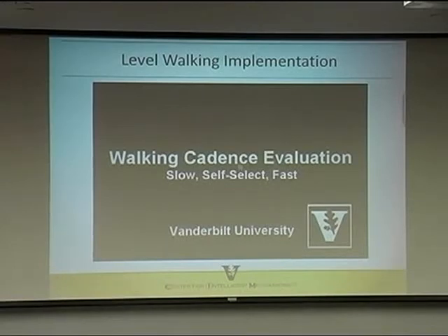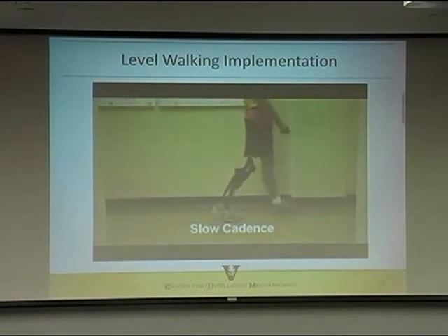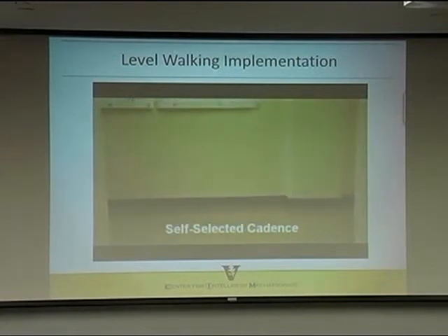And so this shows a subject walking at 3 different speeds, first in regular motion and then in slow motion, just for like a stride and a half or something. This is the slow walking. And so you can start to see, in slow actually you do get those features. It's easier to see in the self-selected and fast, so I'll wait for that, and I'll point it out in the slow motion version of self-selected. So this is self-selected speed.